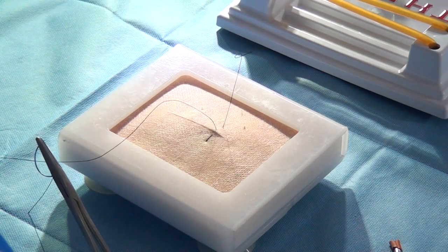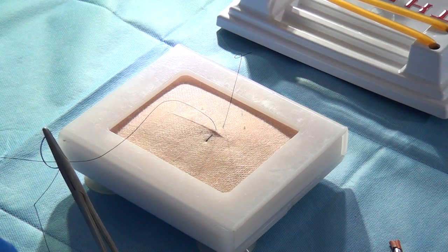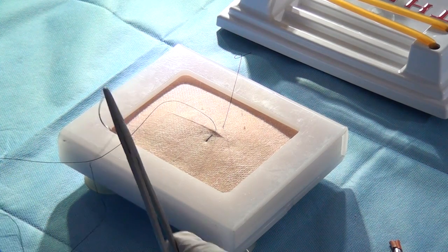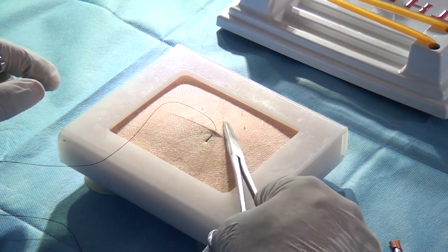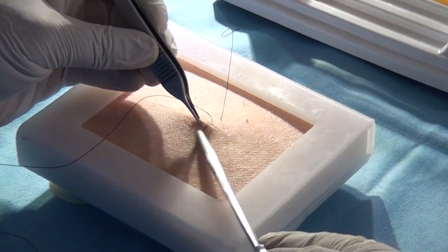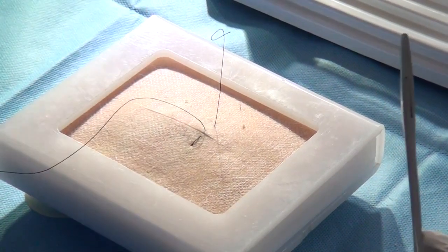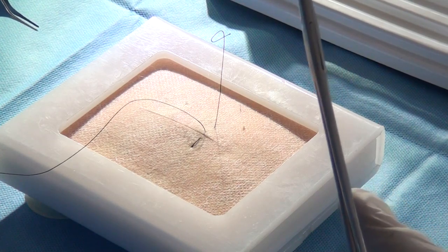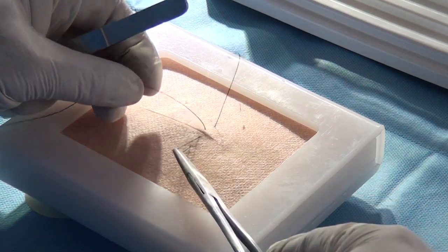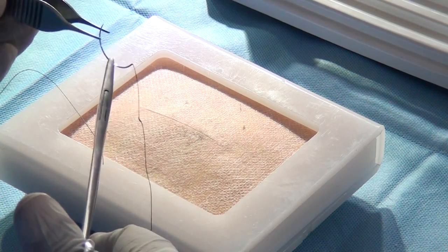So far clear? Not clear? Oh, who is saying no? Raise your hand because I can't hear. What is not clear? Was the first part clear? Second, I went reverse, superficially in the same axis, taking just about the edge of the incision. That's it. That's a vertical mattress suture. Clear? Now I'll show you the horizontal mattress also, and you will probably understand.